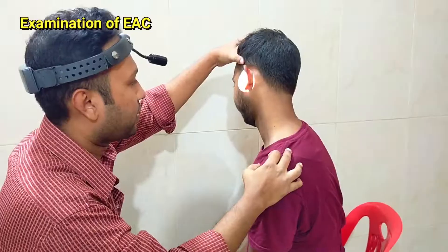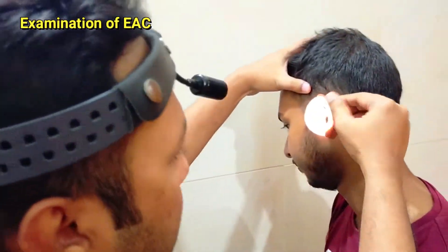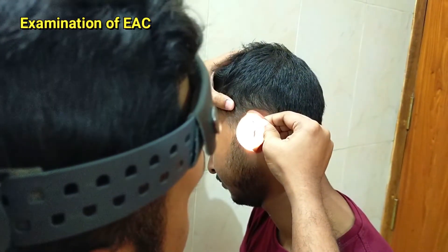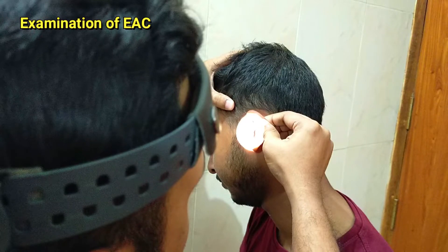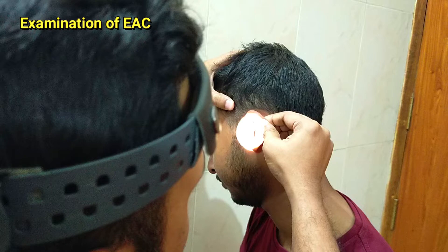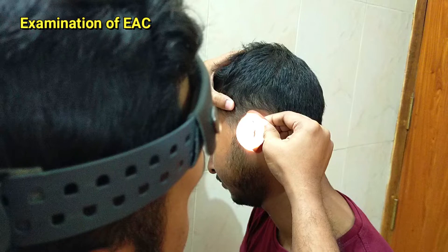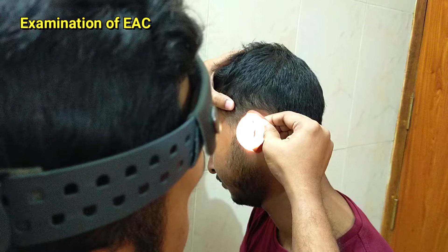Next we have to inspect the external auditory canal. The external auditory canal is not straight; it is made straight by pulling it upwards, backwards, and laterally. In the case of an adult, we have to examine the roof, floor, anterior and posterior wall of the external auditory canal and look for any pus, foreign body, wax, debris, polyp, or growth.